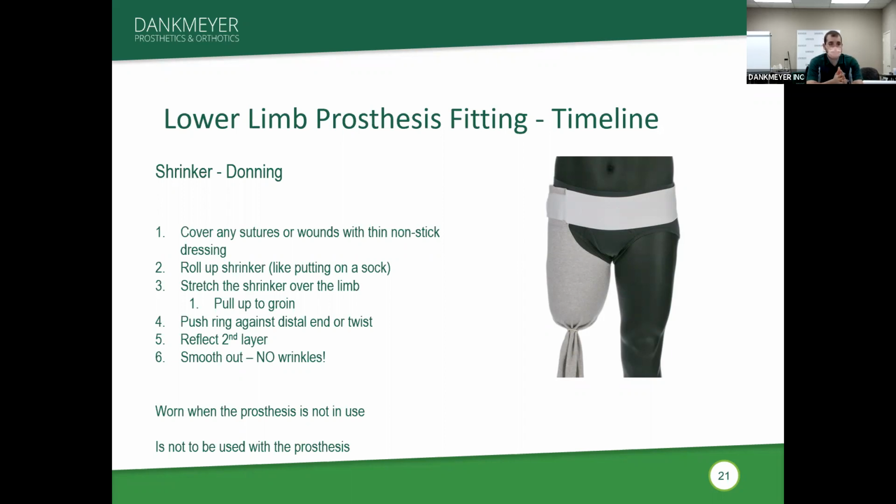And again, shrinkers are used 23 hours a day. Even when they're in the preparatory prosthesis, it's a good idea to put the shrinker on and use it when the prosthesis is not in use. And it is not to be used while wearing the prosthesis.